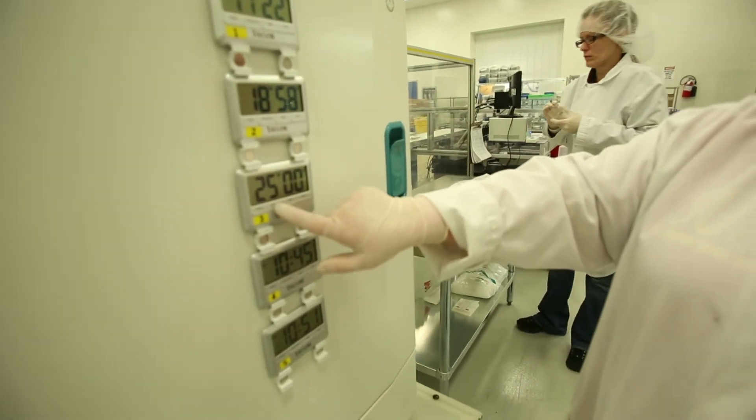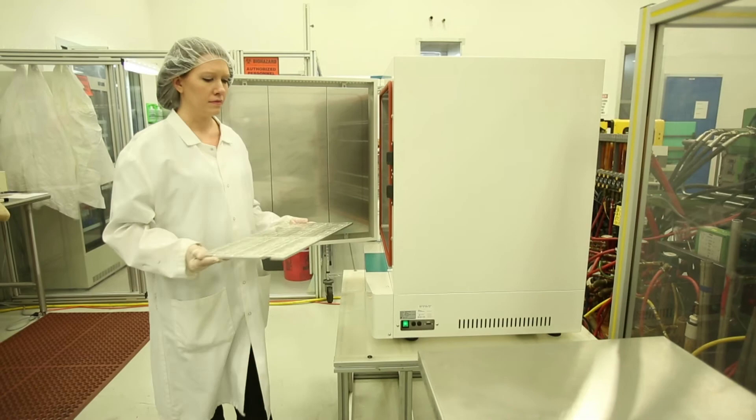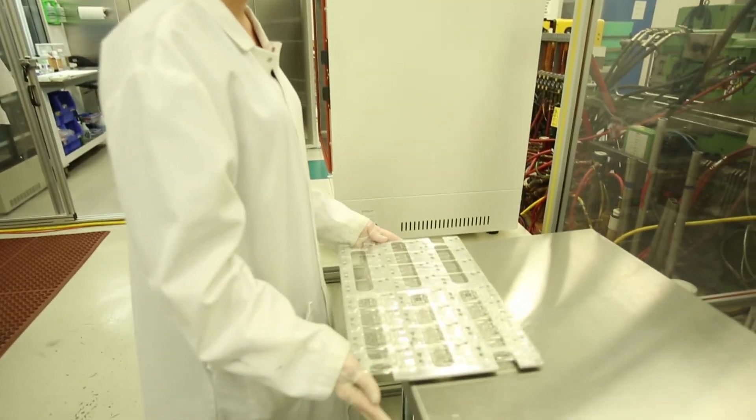This allows for the extended shelf life and portability of the formulas. After exposure in the oven, the parts are now ready to be assembled.